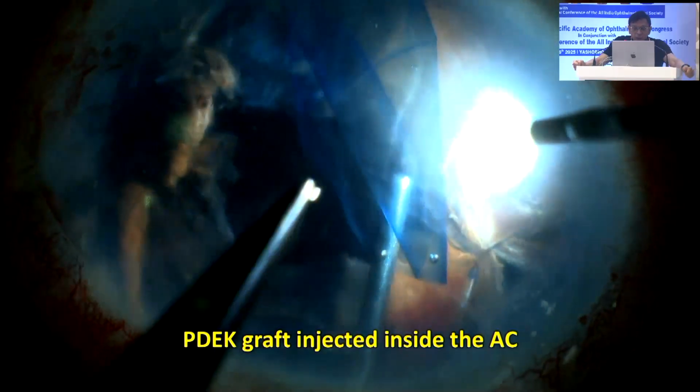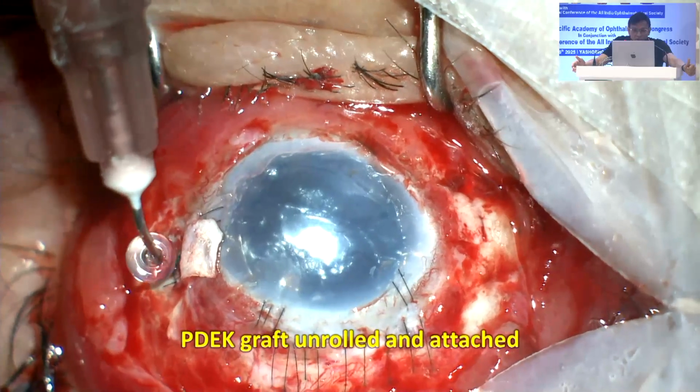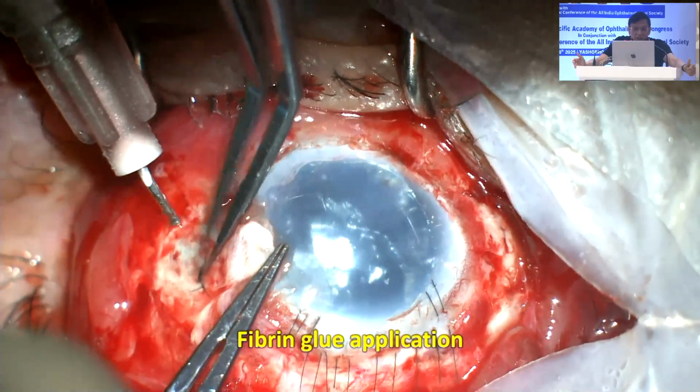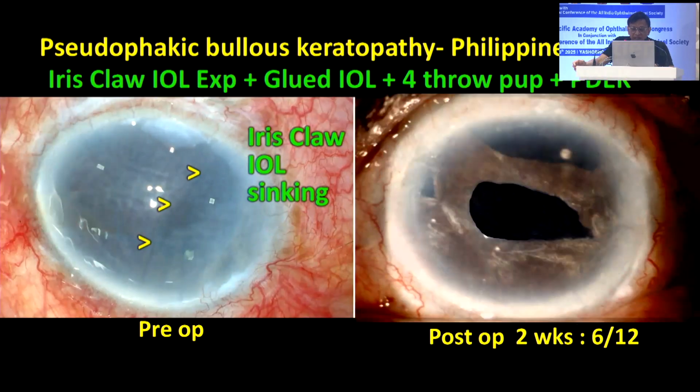So in this case, what did we do? We took out the iris claw lens. We fixed the glued IOL. We did the four-throw pupilloplasty with the trocar-assisted iridodialysis repair, ended with PDEK, post-op day 4. And now you can see the patient pre-op, post-op 2 weeks, vision improved to 6/12.